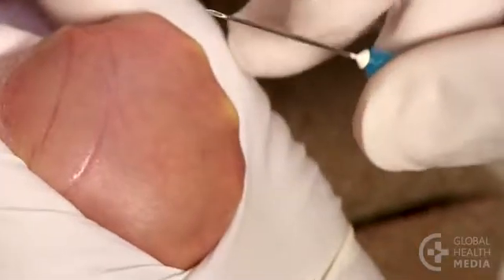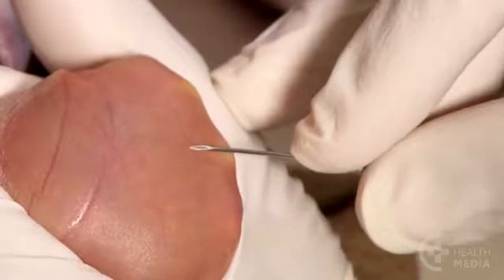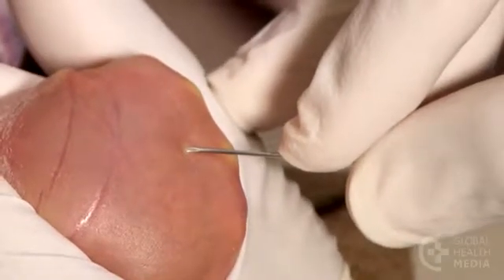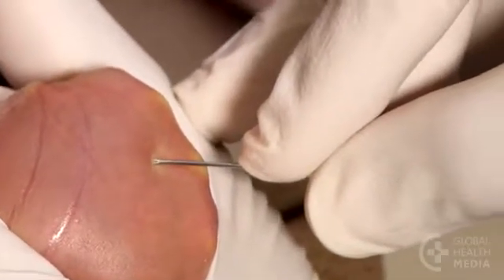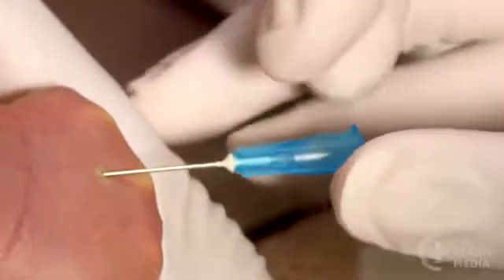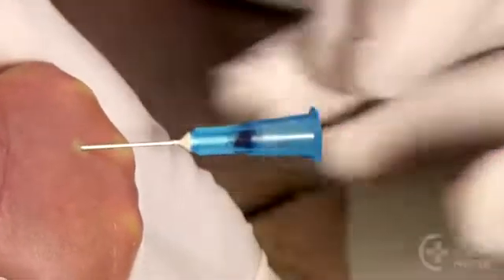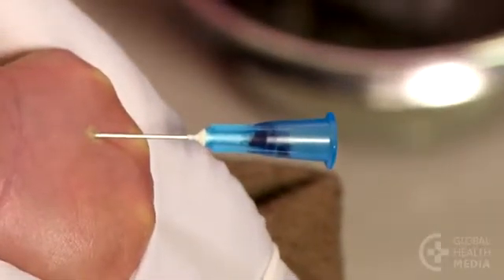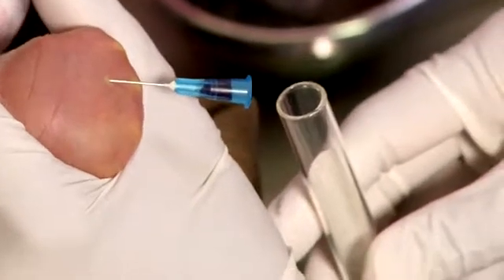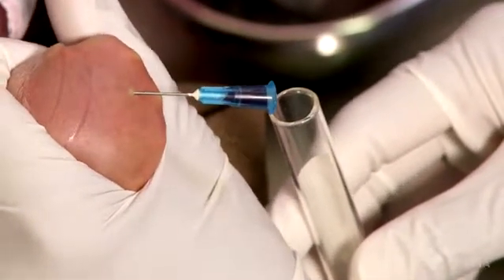Then, taking a shallow approach, insert the needle through the skin. The opening in the needle faces up. Barely move the needle, just until you see blood coming. Hold the tube under the needle and gently squeeze the baby's hand to bring the blood.